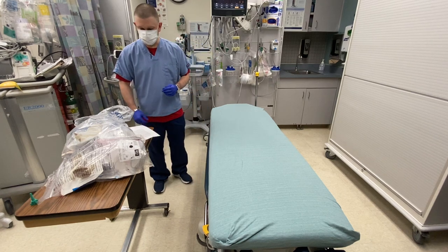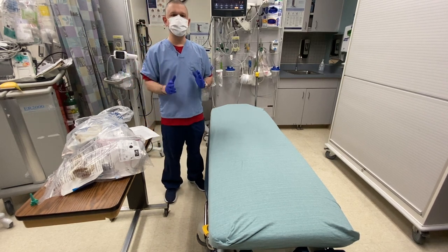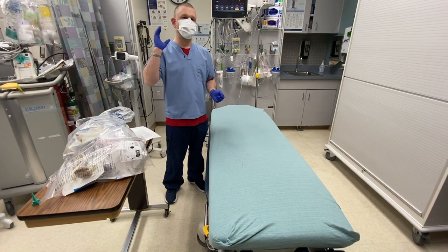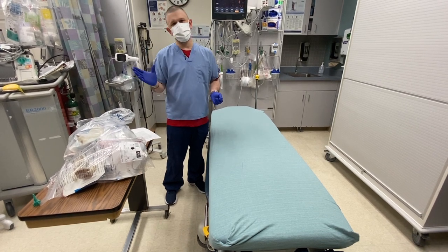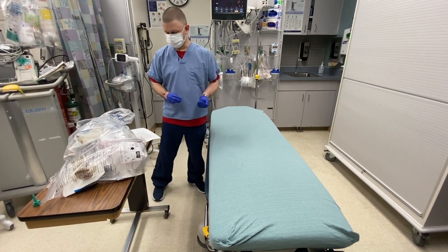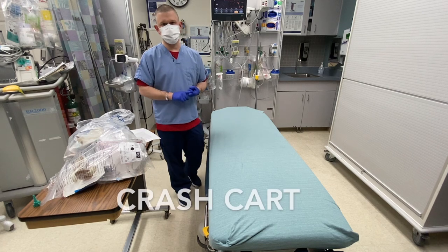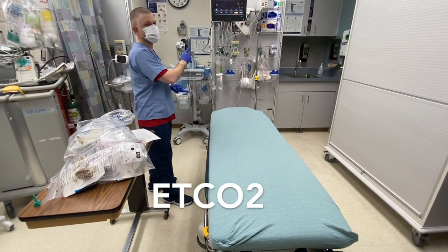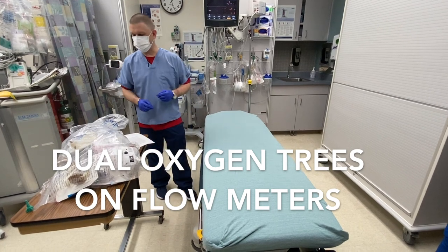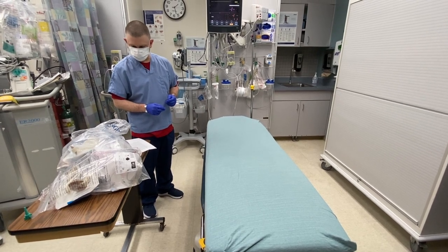Now we're going to go over an overview of the procedure very quickly. We are going to make sure that we have our equipment in the room already with the patient that's suspected of having this. We'll have equipment immediately outside the room that will be brought in by the three personnel who are going to be the team managing this patient's airway. Number one, inside the room you have to make sure you have a crash cart, end-tidal CO2 capability, and two oxygen trees on our flow meters. I think that is about it as far as what has to already be in the room.